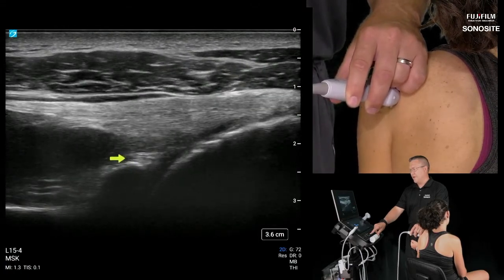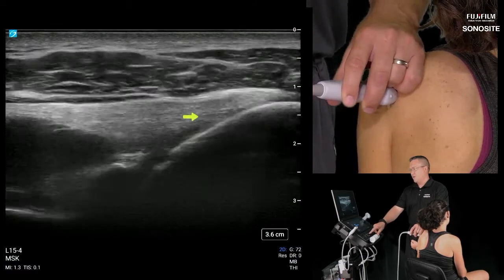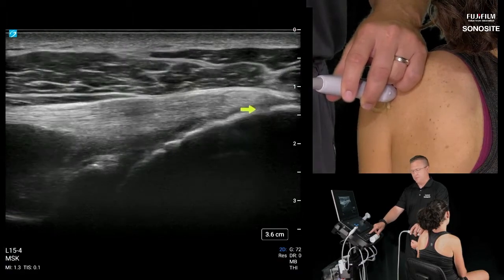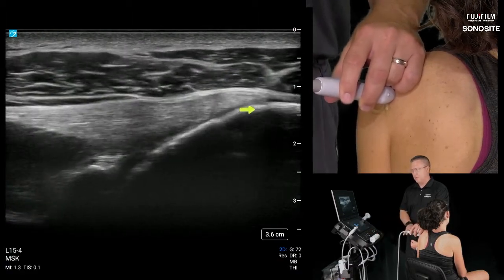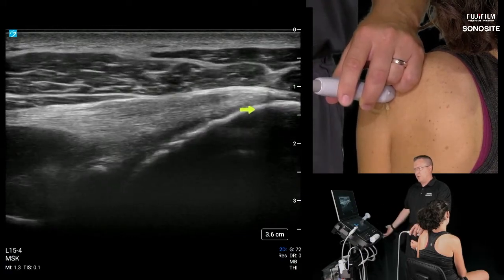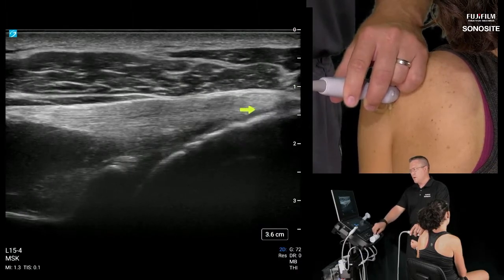So I'm pointing at the capsule's interface. This is the central tendon of the infraspinatus. We have gone into external rotation, which has brought the enthesis posterior. So this is the anatomical position. If you're looking at an anatomy poster or book, when we're in external rotation, we expect to see the infraspinatus back here.